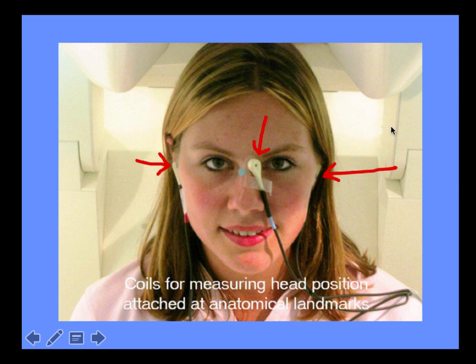We need to know where this person's head is in order to understand how our signals are coming from the anatomy. So we place a number of coils on the head at the nasion. That's a very sloppy job. I hope none of our users actually do it like that. What I mean is that it should be right on the nasion, which should be right in the middle there, not off to the side like that. And then we also put them on the preauricular points according to a little rubric that we have. We can locate the signals from these coils exactly, and that tells us where the head is relative to the set of sensors. And then we can also image these coils with vitamin E capsules in the MRI and use those as fiducial points to align our MEG reference frame to the structural MRI of that person.